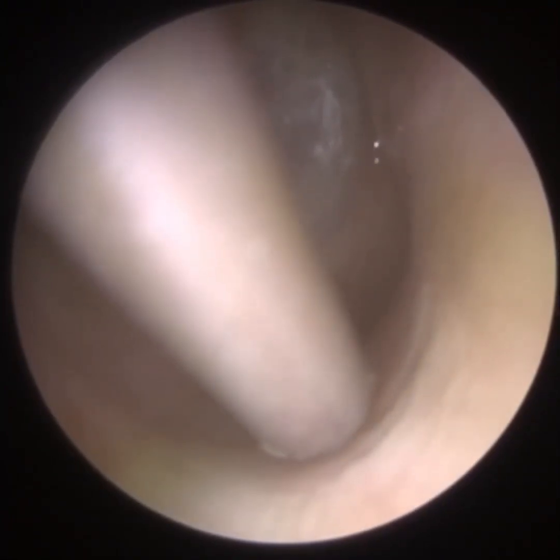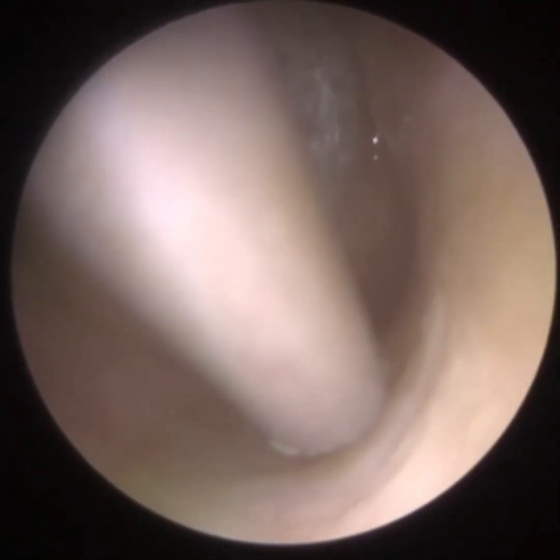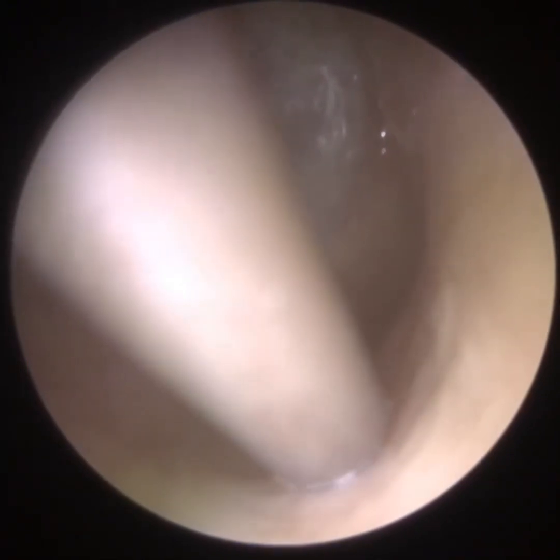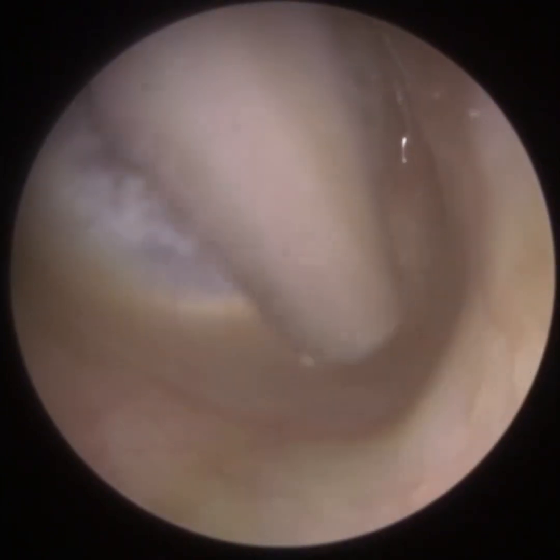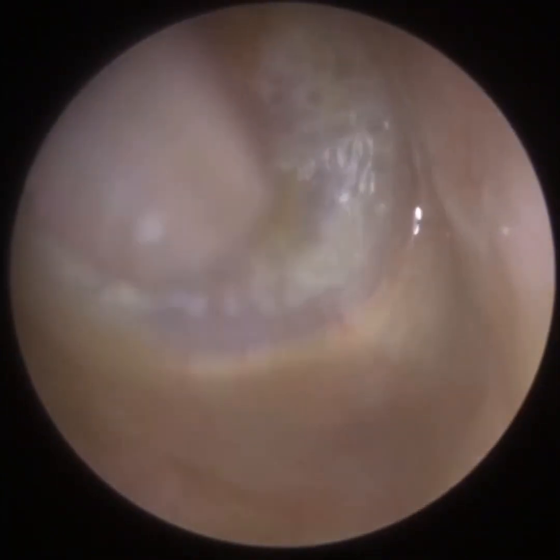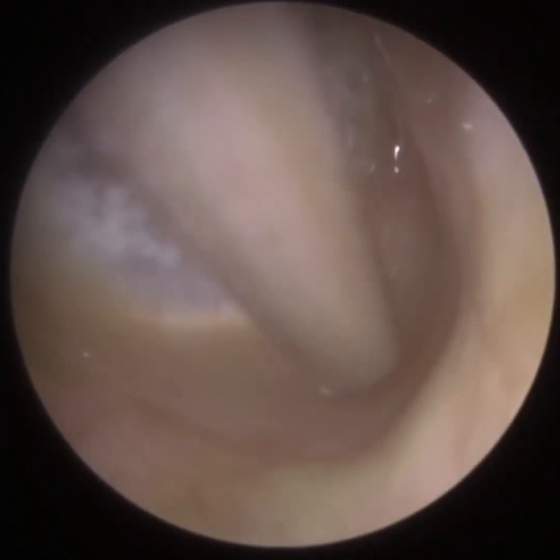We are approaching the patient's medial ear canal — the inner two-thirds — and here is the isthmus, the narrowing of the ear canal. Now we're in the inferior recess, and this inferior recess is a lot more widened than normal.